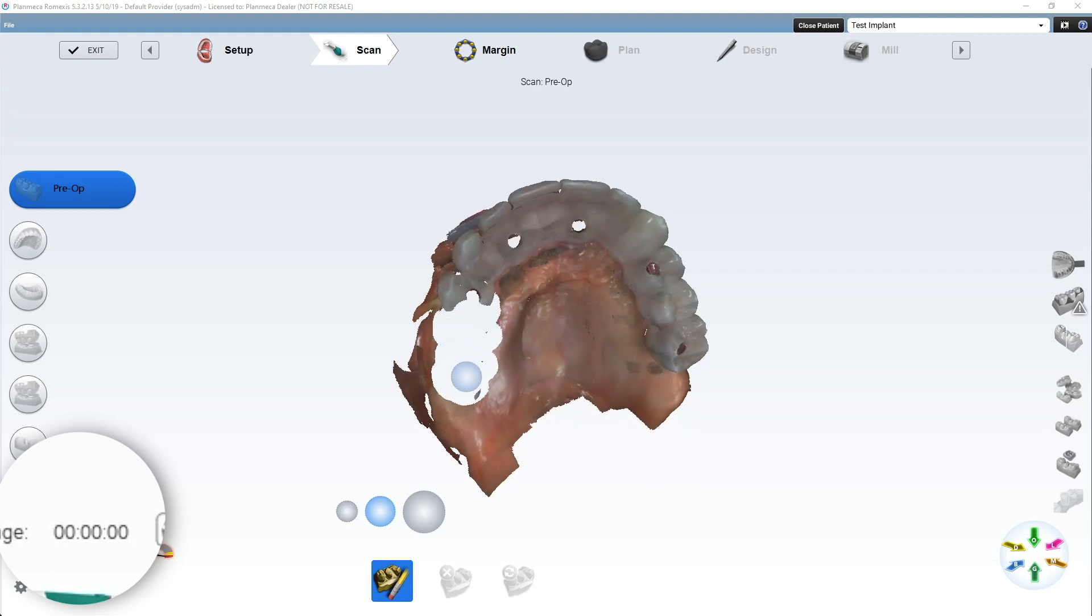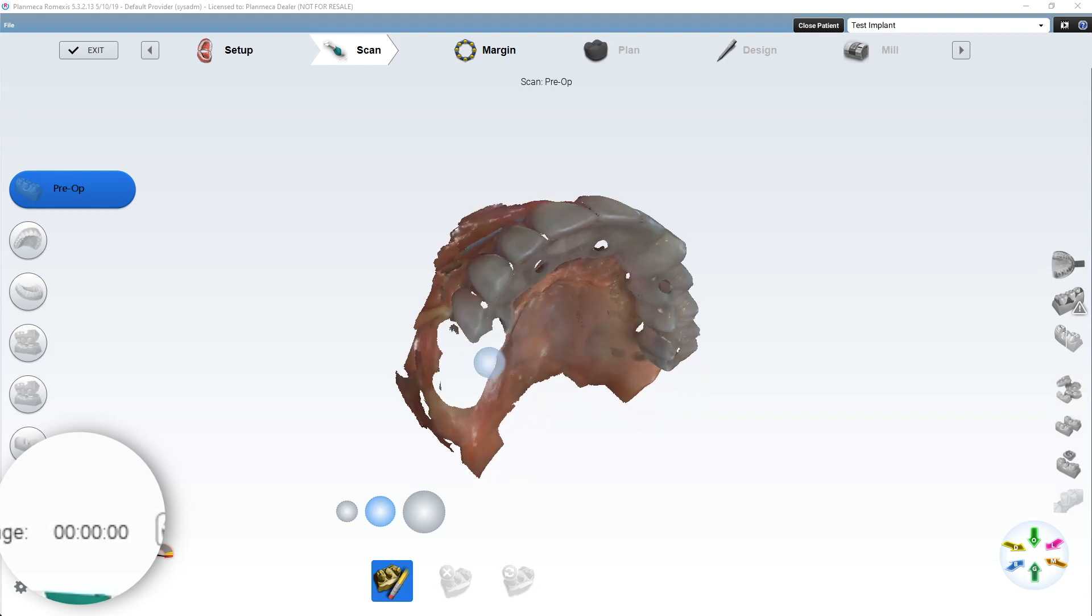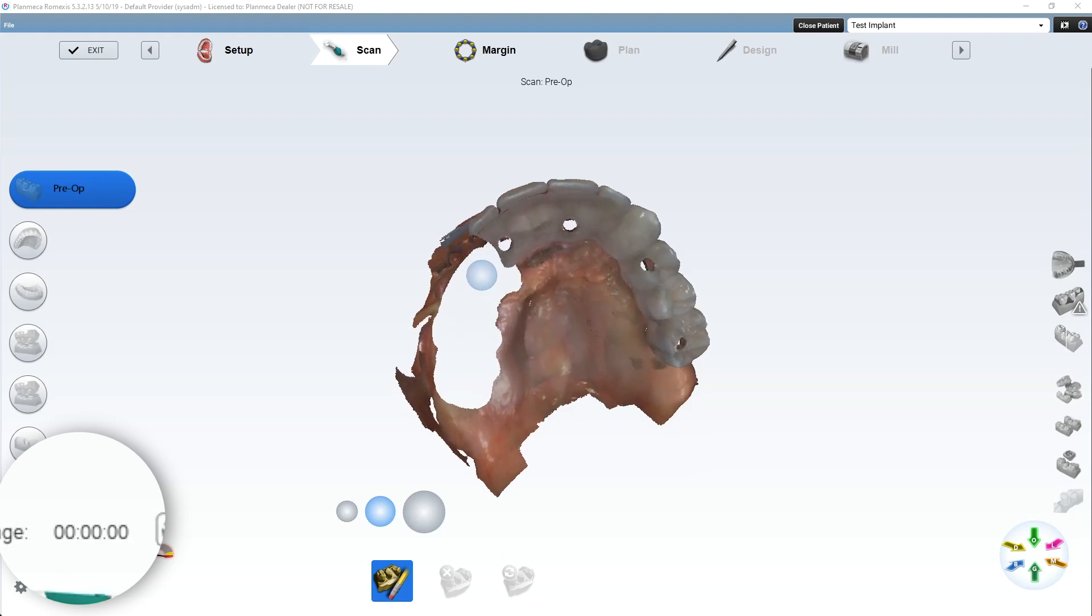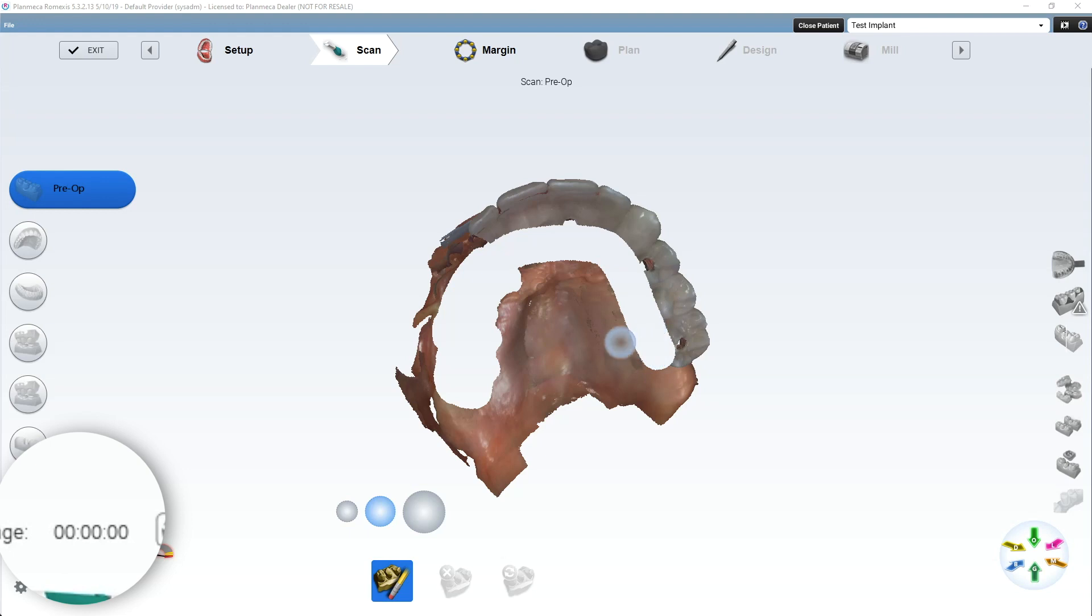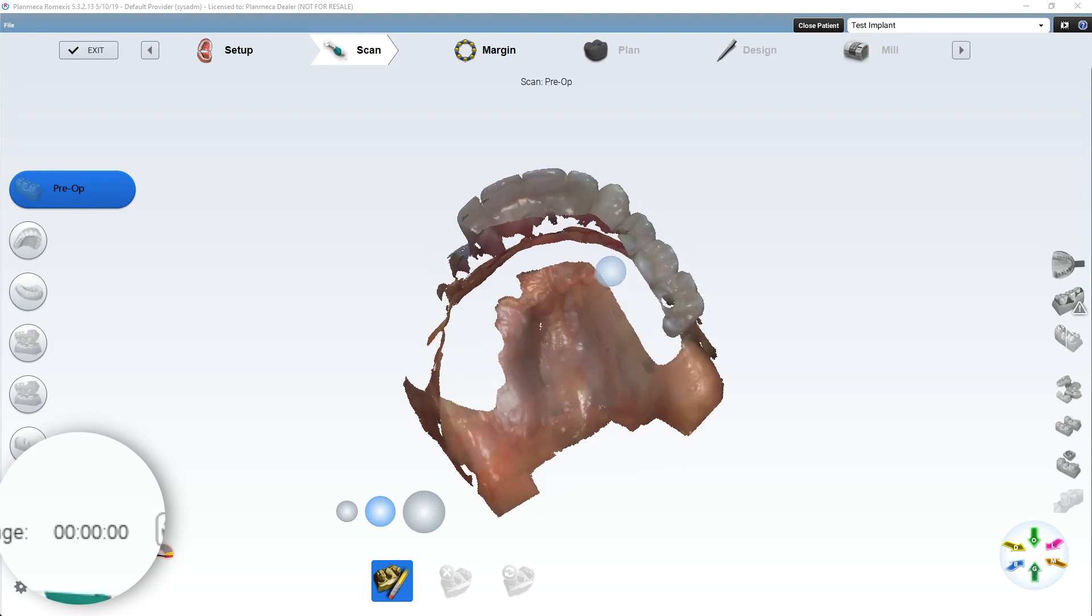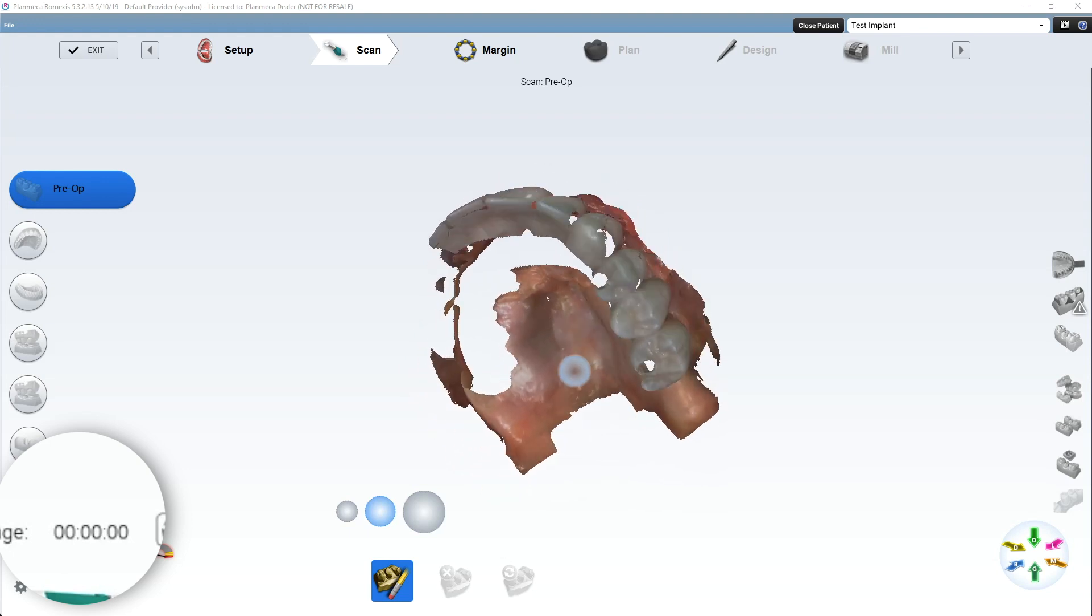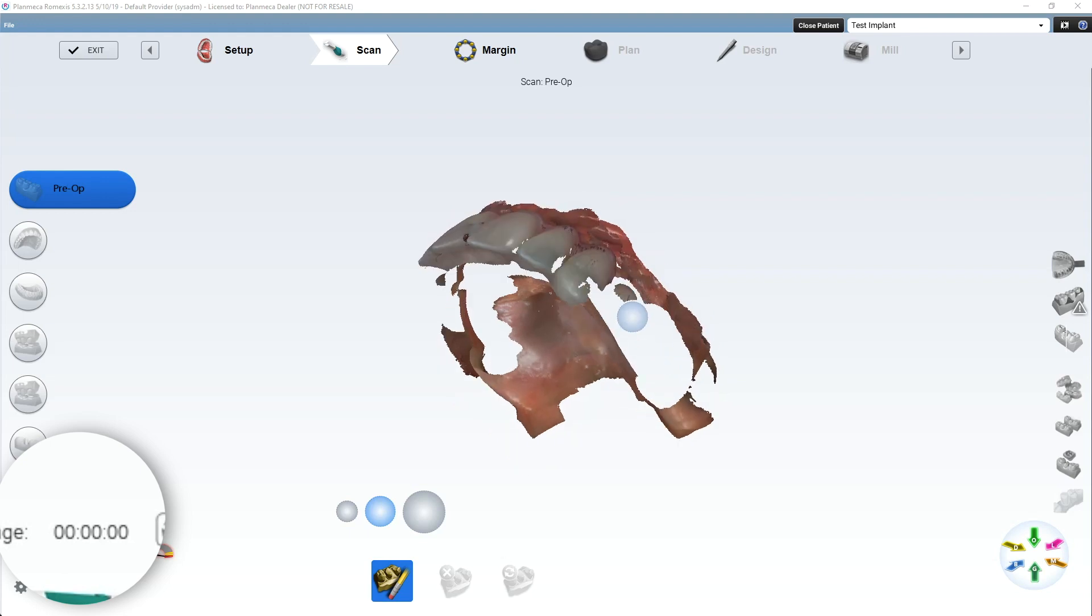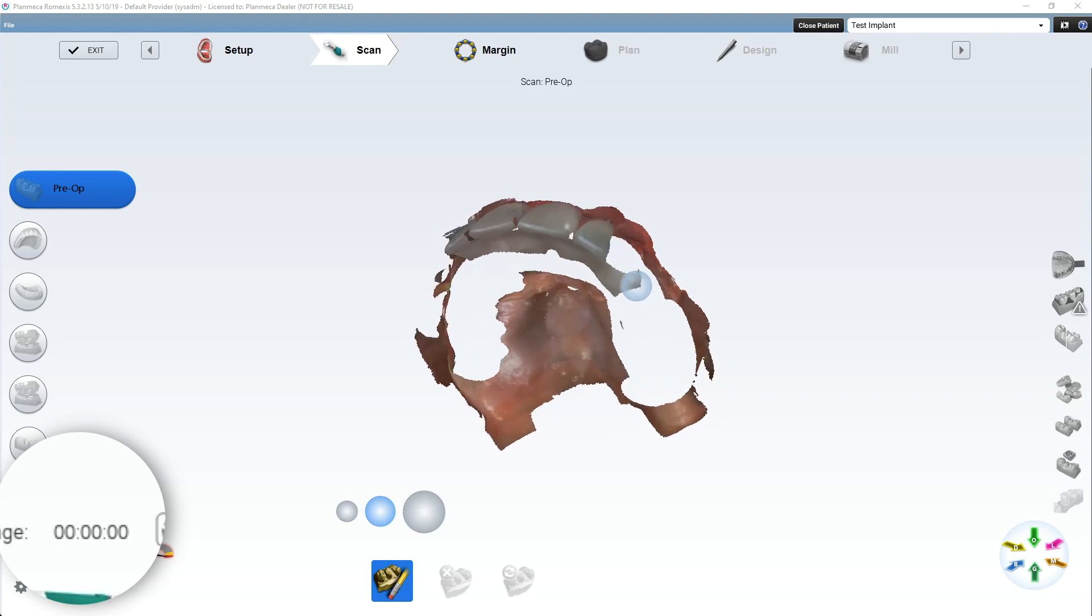And I'm going to do a, this is a multi-unit case. So I'm going to scan the multi-unit. Soft tissue scan. Being really careful, I want to maximize the amount of palate that is on this. So spend a little bit of time erasing this. Okay. Trying to keep maybe even a smidge of facial tissue there to help with alignment.